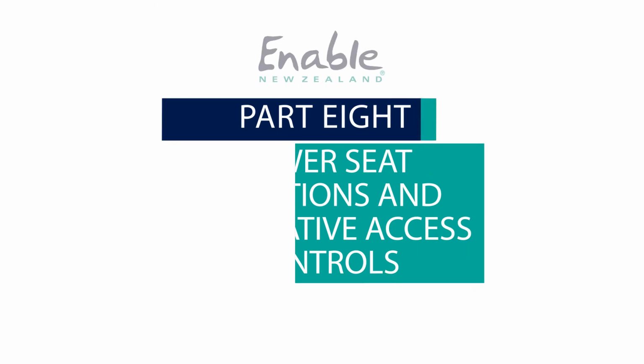If you've got fewer switches, you do need to get creative about how you're going to access your on-off mode, and this is when you're looking at your double tapping and programming the speed at which you need to do that double tap and that sustained hold. Someone who's cognitively able might manage that, but it can be very frustrating for those who struggle to learn it. So you've got the trade-off: you can have lots of switch points and switches doing different things, or you have fewer switches but the switches are having to do more things.